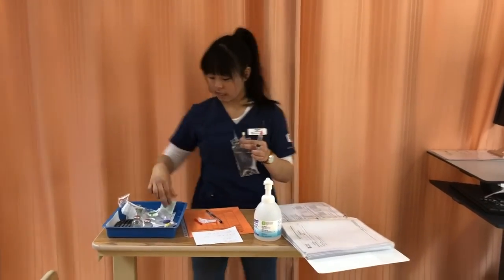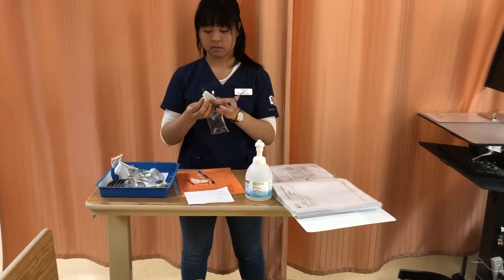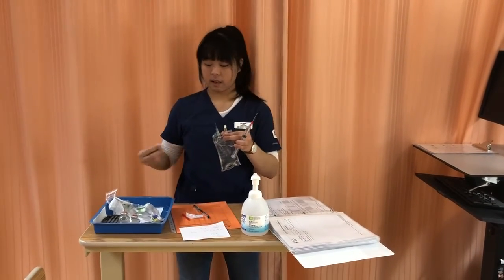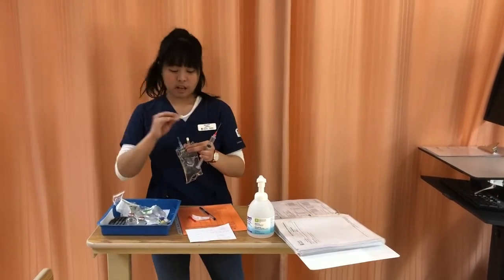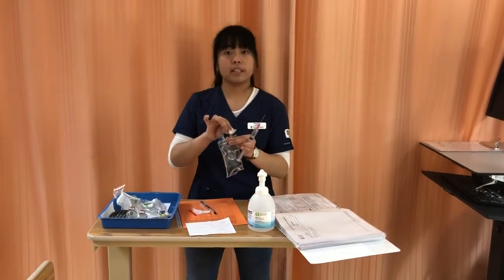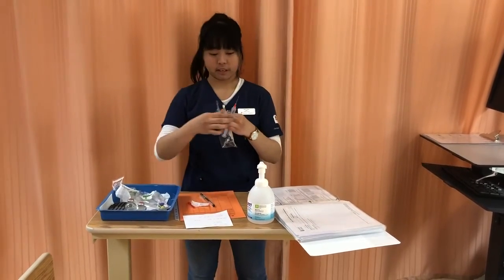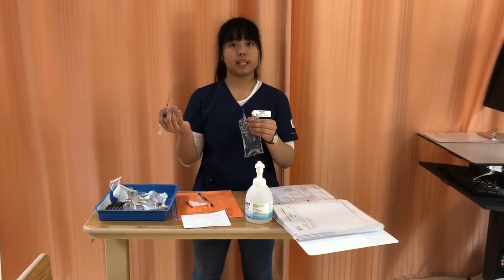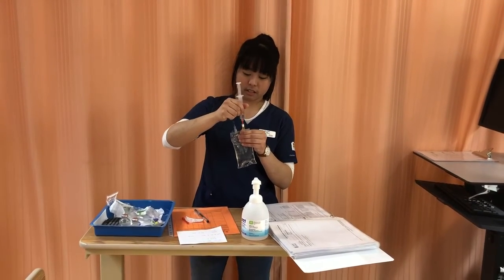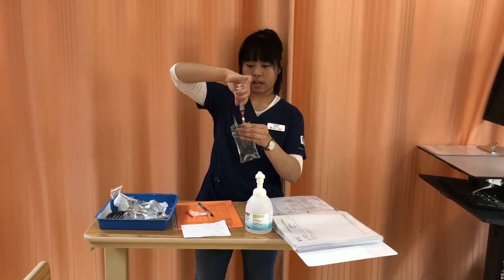Because I just touched that, I'm gonna take another alcohol swab. Okay, so I'm just gonna get another one. And for the purpose of the video, I'm just gonna use the same one, but in reality, I will get another alcohol swab to maintain sterility. And I will be cleaning it for 30 seconds, let it dry for 15. So I'm just gonna inject that, like so. Check my medication, and take it out.